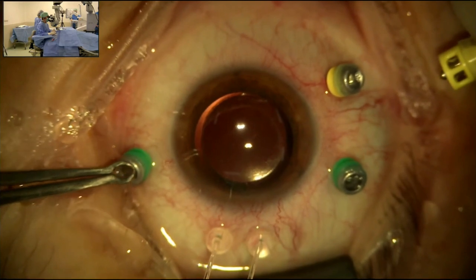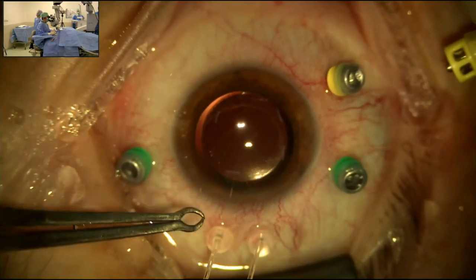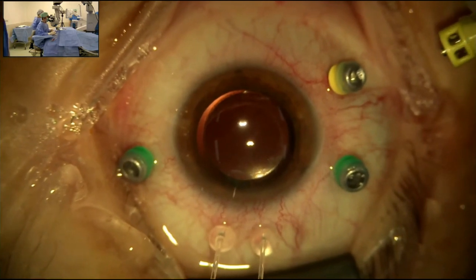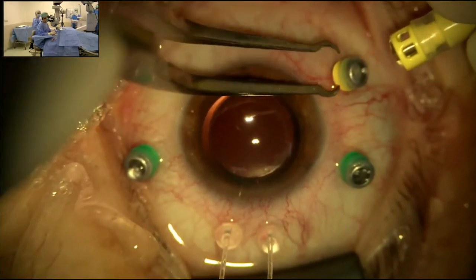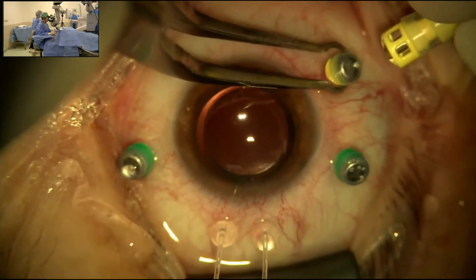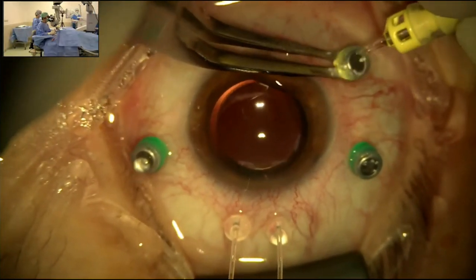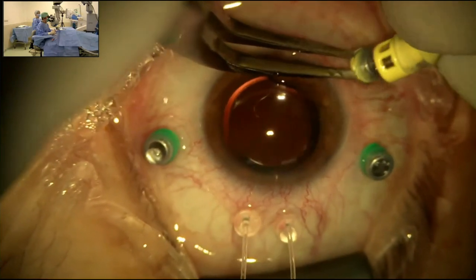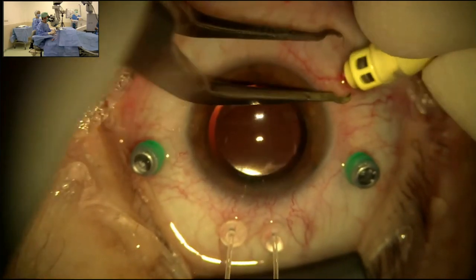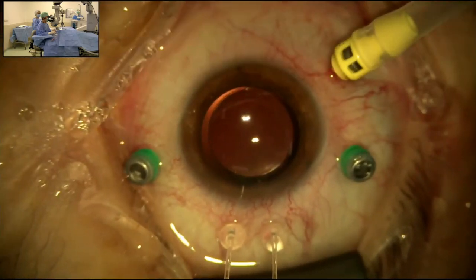I use a hybrid trocar system, 23 gauge, and the infusion is 27. Also, I use a chandelier light regularly. This is my standard setup. The new trocar system has very easy connection, so we don't need to remove the valve. After opening the infusion, as you see here, we can easily connect the infusion with the trocar. So this is okay.